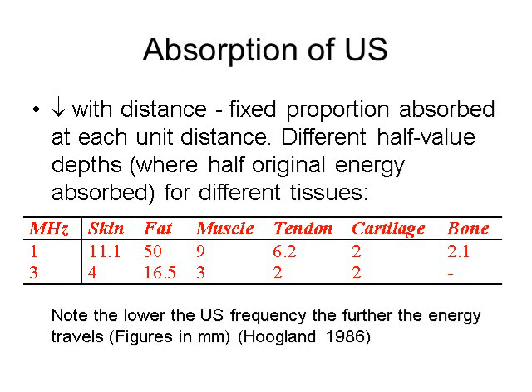You will see that lower ultrasound frequencies travel deeper into the tissues.